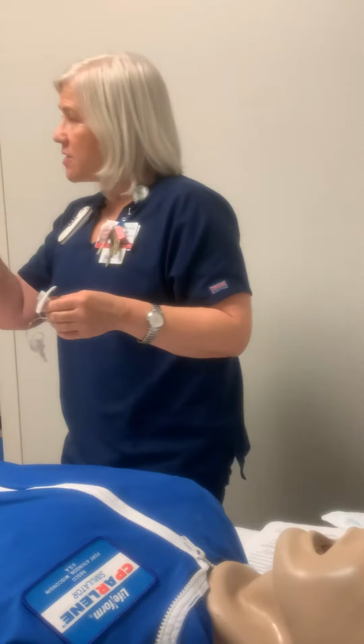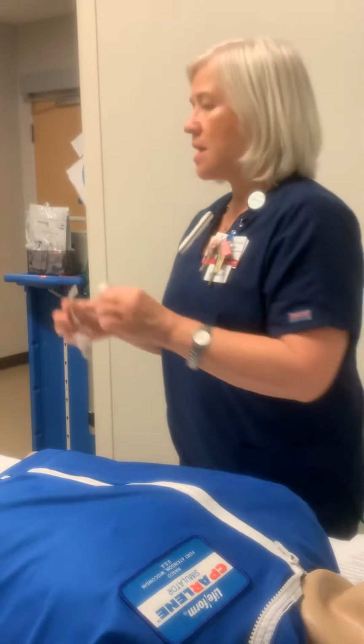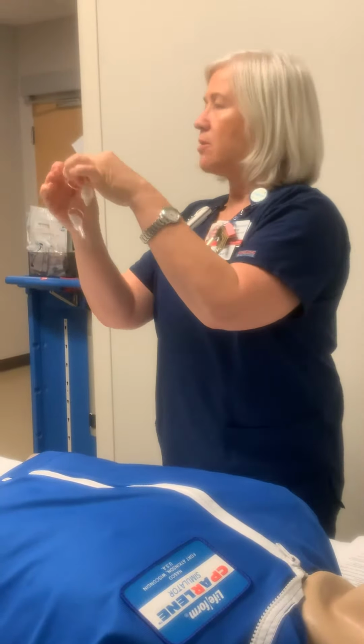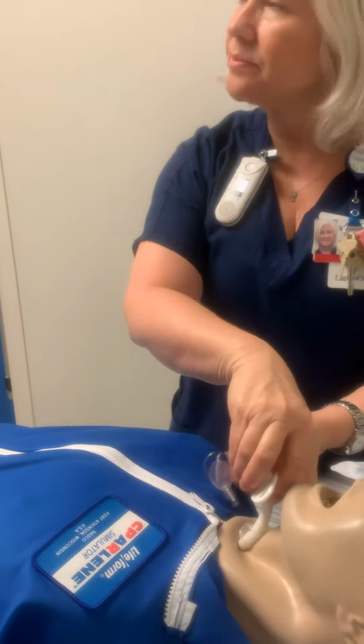So you have to have an obturator, okay? And a lot of times I'll ask nurses, what's the purpose of an obturator? And they'll say, oh, it's to hold the airway, put it in the airway. That's not the purpose. The purpose of it is kind of like, to me, a guide wire. You put it here, and then I'll come in and reinsert it.